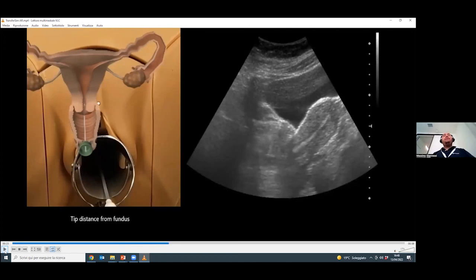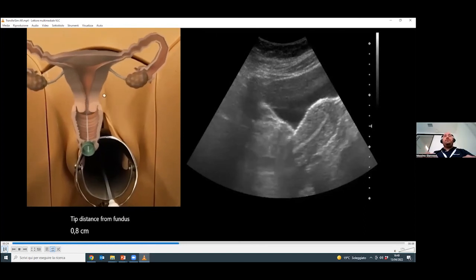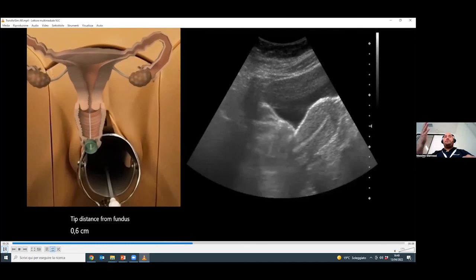And actually you can see live the catheter going inside, and you can see where the user released the embryo in an augmented view of the procedure, of course, because usually it's impossible to see this cut plane of the uterus.